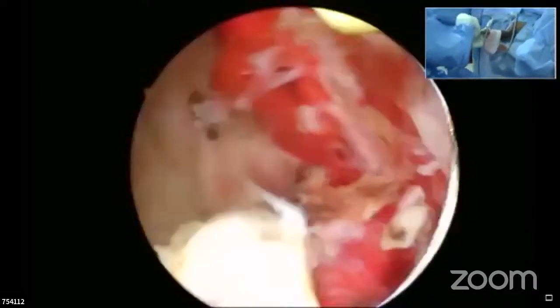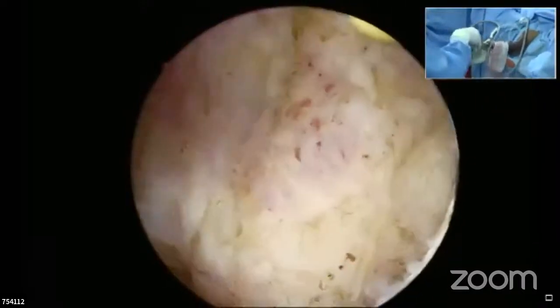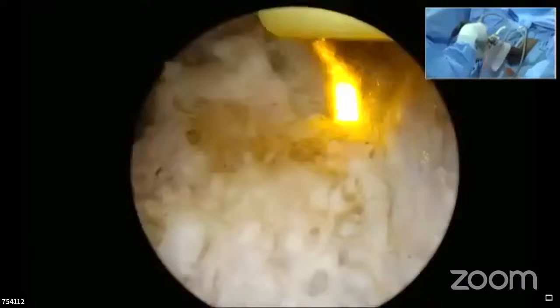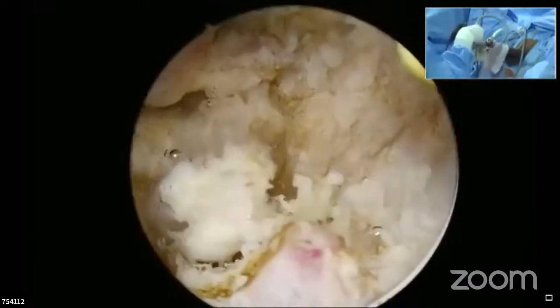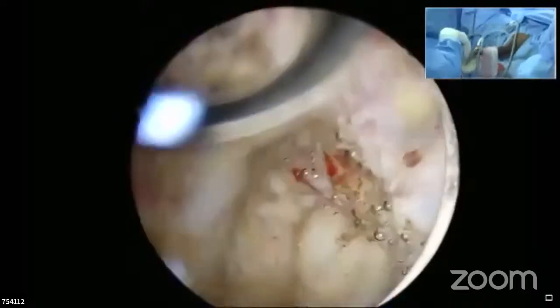How long has he been operating now? 1.5 hours, sir. All right. Are you concerned about the time that you spend in the urethra? Resection time is 1.5 hours, or total time you are saying? Sir, it is resection time. Resection time is around 90 minutes now.